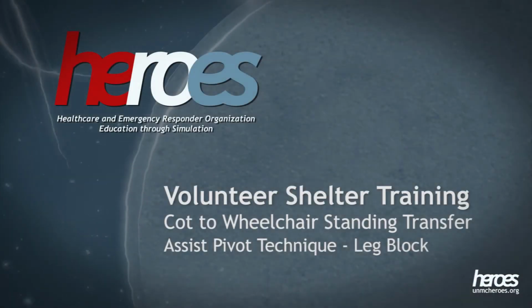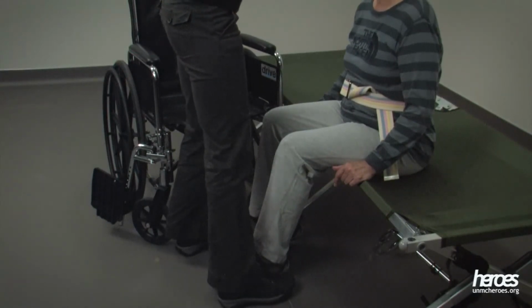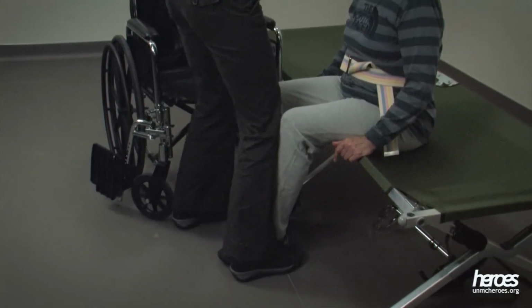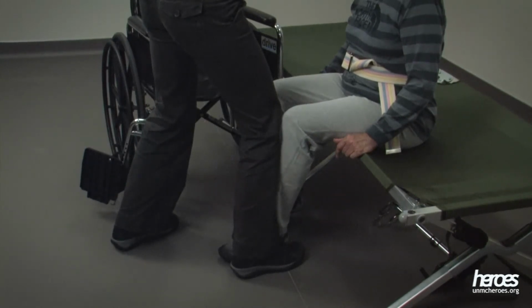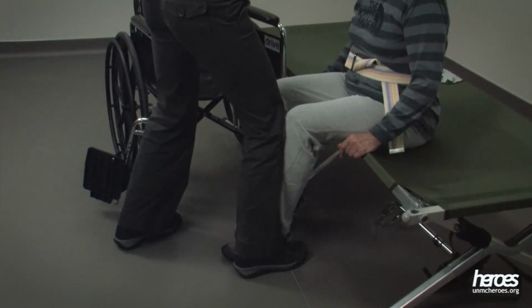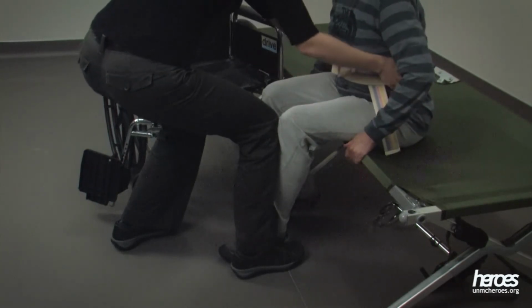To help transfer some individuals, you may need to block their weaker leg by first placing your foot along the outside of their foot and by placing your leg against their upper shin. Make sure your other leg is positioned shoulder width apart and slightly behind the leg that is blocking the individual's weaker leg. Then place your hands on the gait belt, encourage the individual to lean forward, and coordinate together to come to a standing position.